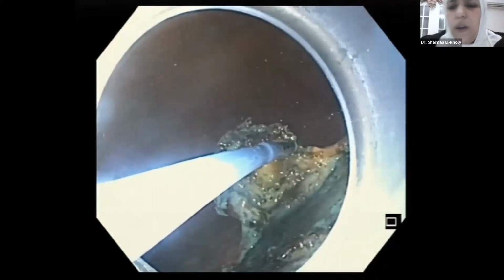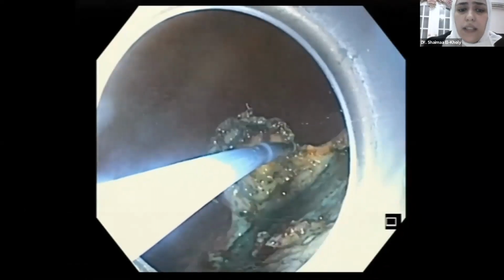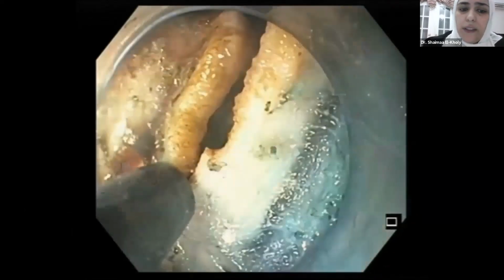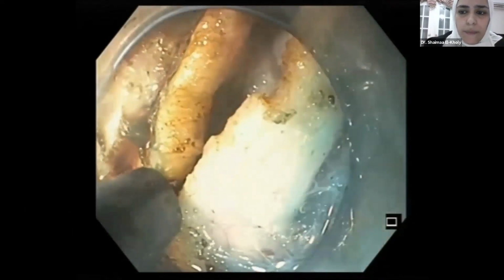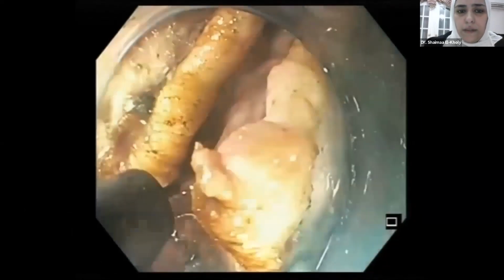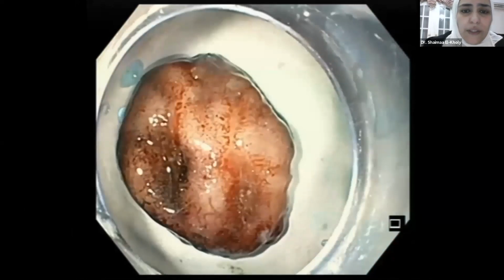And afterwards, it's almost done. It's just the final cut. Here we shift to the IT knife. This IT knife has an insulated tip knife. So we dissect with the shaft of the knife. As you can see here, that we are separating the lesion. And here is our final cut. So here's our lesion.